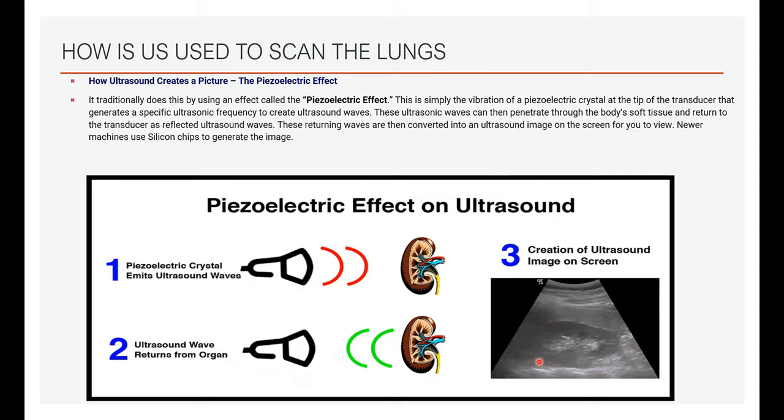But with the lung, unfortunately, what we're not looking at in entirety is the anatomy, maybe some of the superficial structures up to the pleura. A lot of the other aspects of lung ultrasound are interpreted through artifact. And it's quite interesting how most ultrasound machines are designed on the principle that if artifact is generated, it should be minimized. The classical images that you used to get with the old machines, which produced a lot of artifact, are filtered out in newer machines. And that's made diagnostic interpretation a little bit more difficult for us.